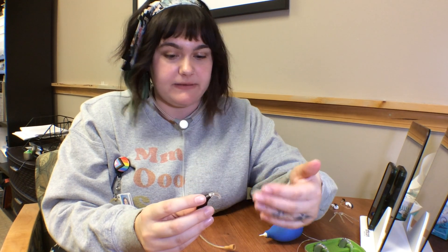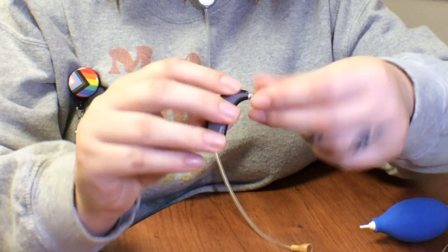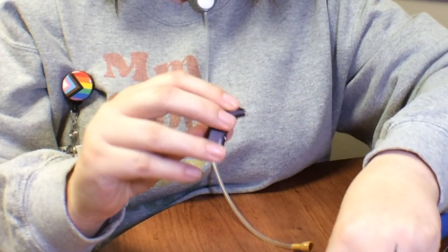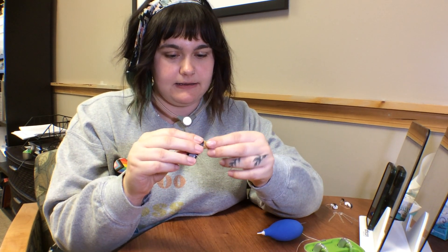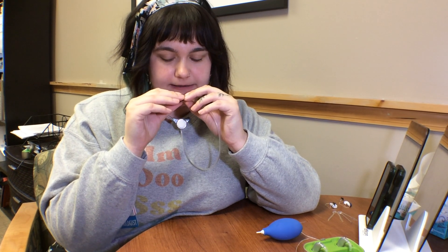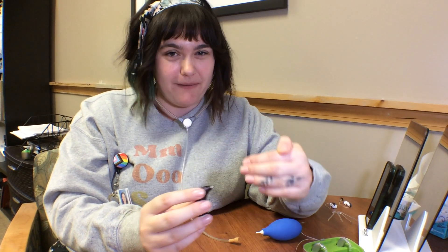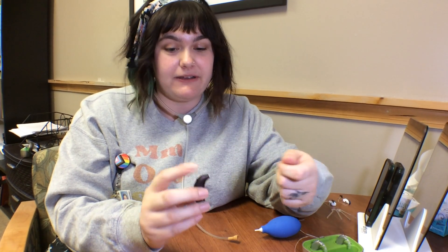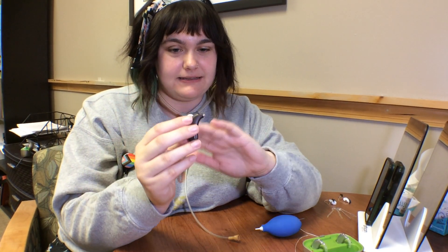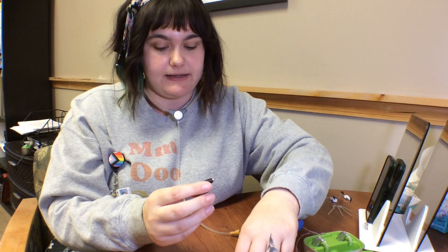As you're going through, if the problem is still not solved after taking the ear mold off, now we're going to take the tone hook off and run that same listening check again. The hope is that as you dissect the hearing aid, you'll find the problem by removing each part. But if you get all the way to this point and there's still a problem, then it's time to have an audiologist take a look at the hearing device.